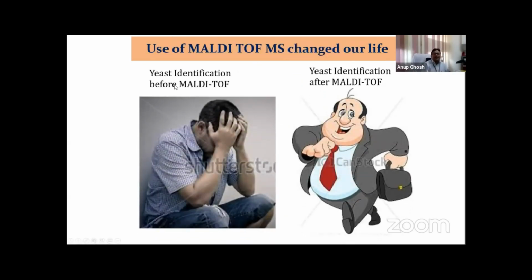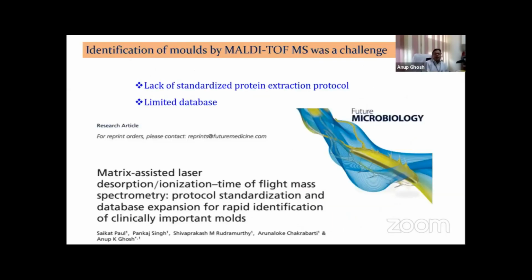So before MALDI, our yeast identification situation was like this. I can tell you, when we started MALDI in our routine, during that time we had around a couple of hundred sugar assimilations pending. But now nothing is pending. Every day we are updating.